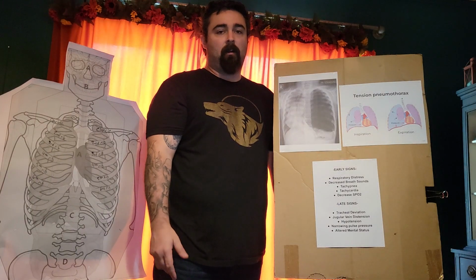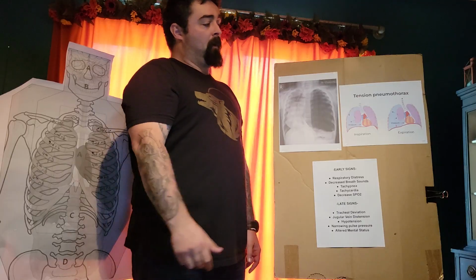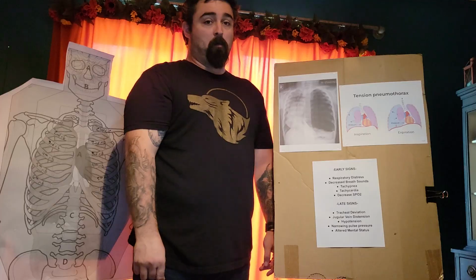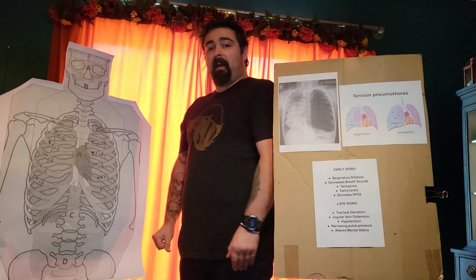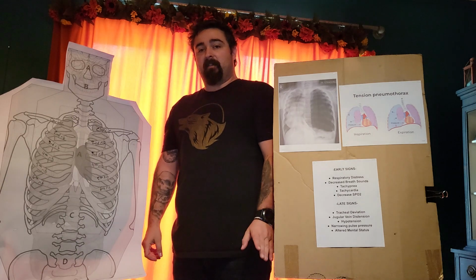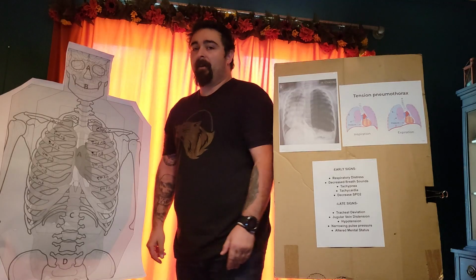Today we're going to be covering how to do a needle chest decompression, or an NCD. We're going to be covering why we perform an NCD, how we perform an NCD, and the signs and symptoms of pneumothorax and tension pneumothorax. And then we're going to move over to an anatomical figure and discuss how to perform the needle chest decompression, and any assessment and reassessment that we need to conduct to see that the skill's been done appropriately and is effective.